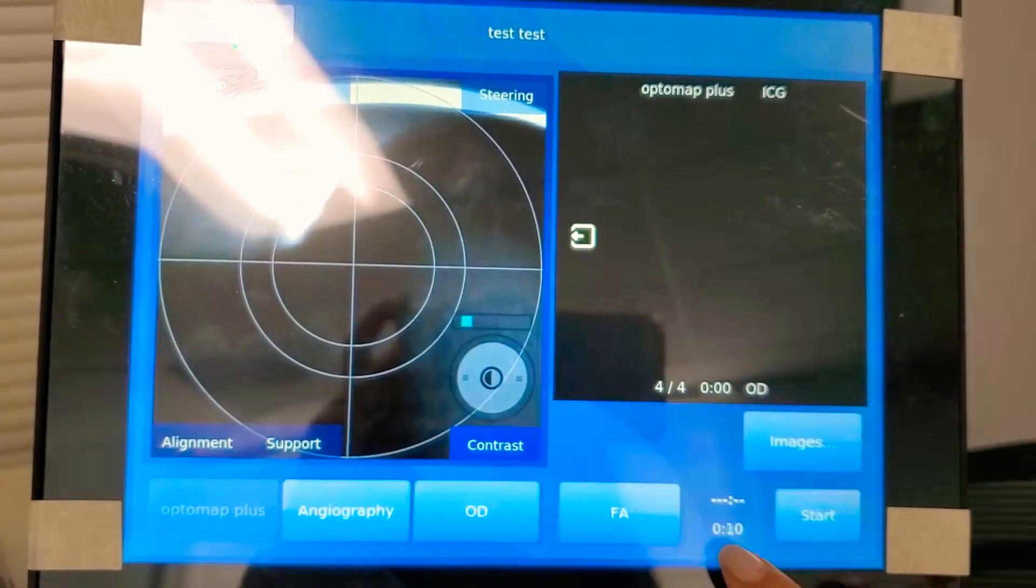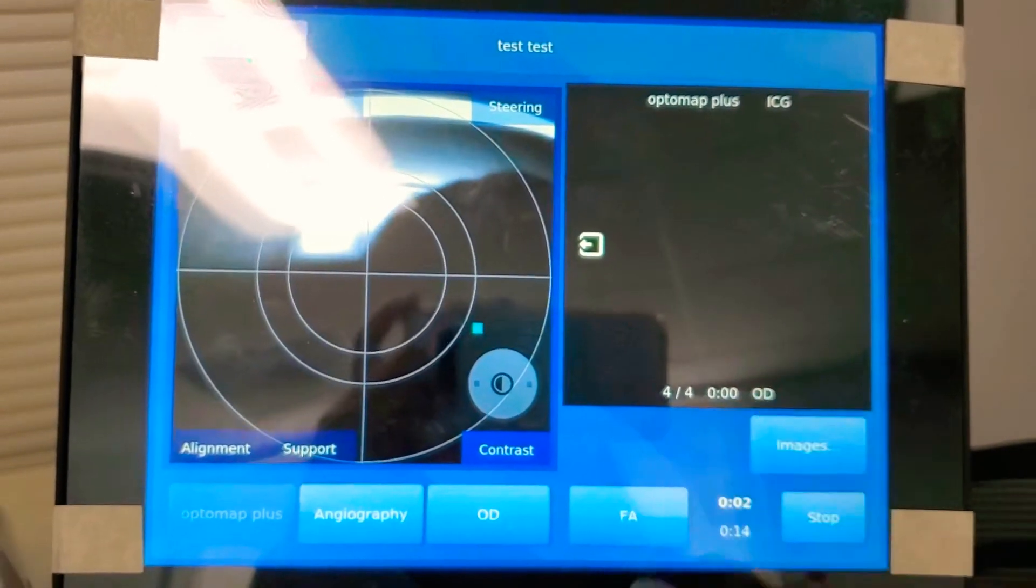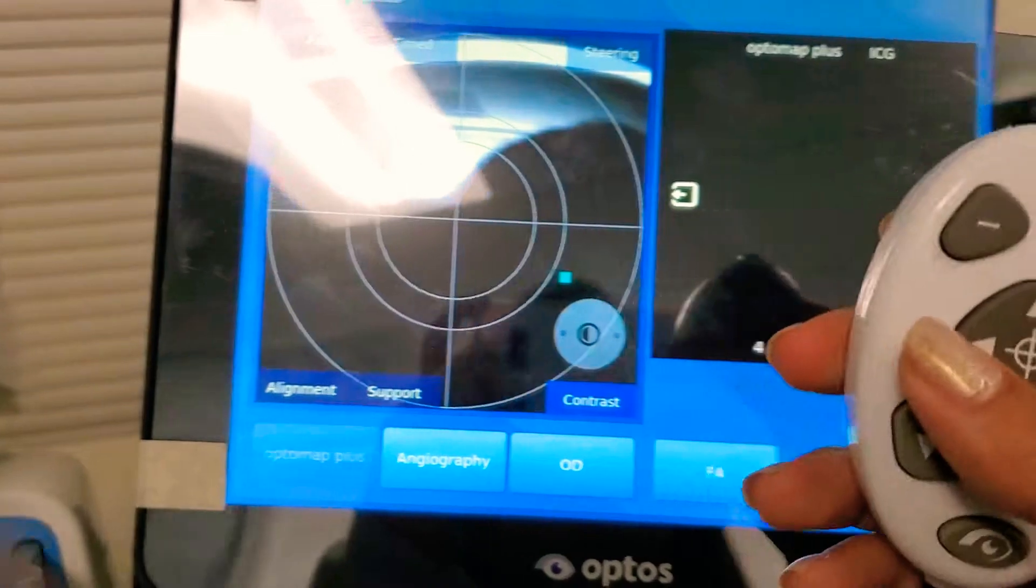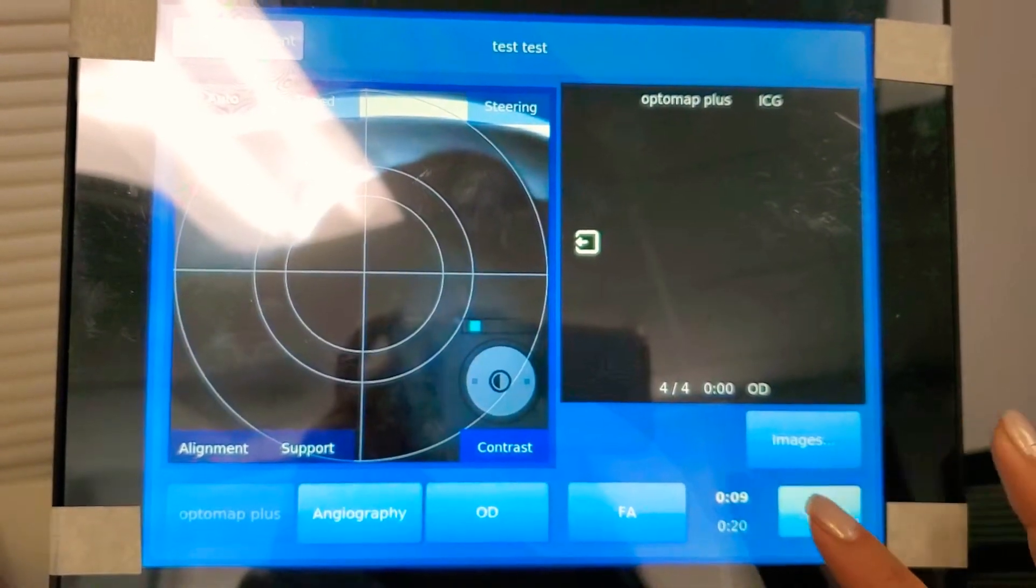And then we're going to do FA. And the timer's right here. So it's already started. You just click start what I actually only did. And then once you've got... Same thing. Make sure that it's on green. Take the photo. And then we can stop.